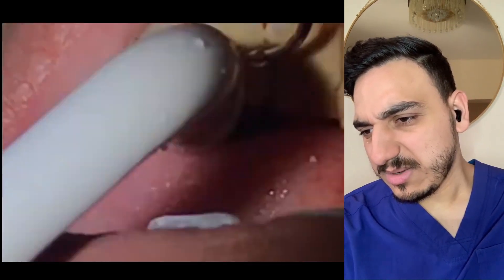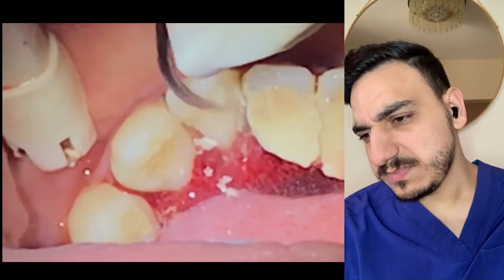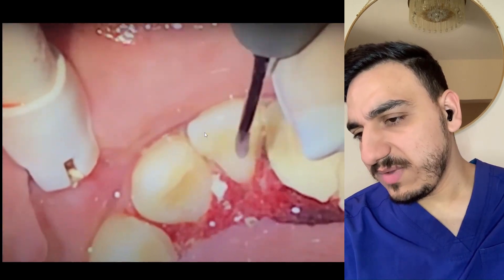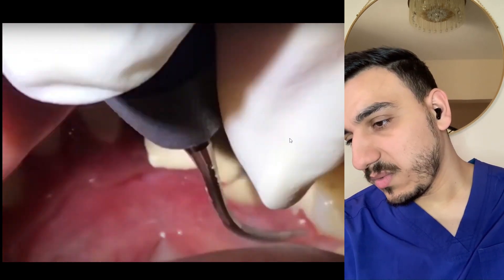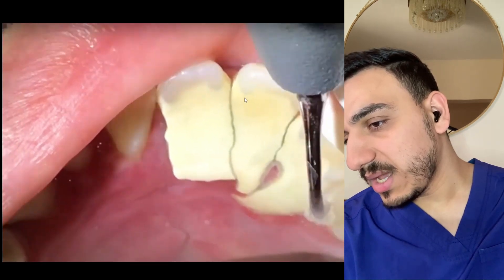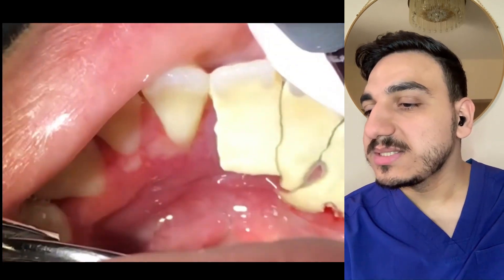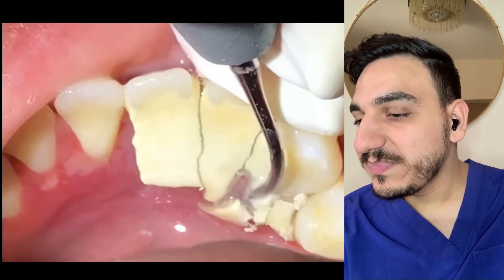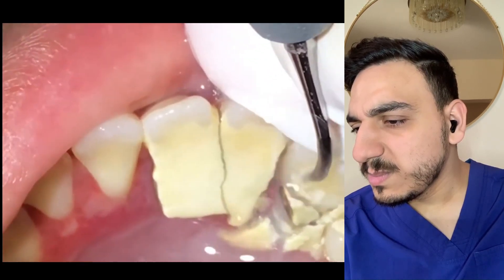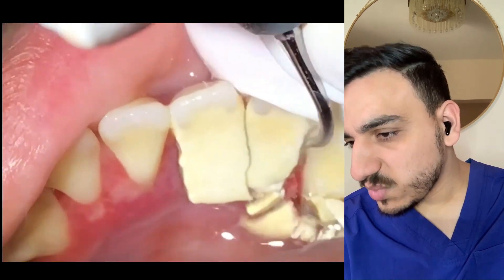Completely insane. As you can see, we're trying to remove even some calculus deposits on the top third of the tooth crown, because this is how far it's extending. It's really a bad case of calculus — we even need to clean those parts as well.